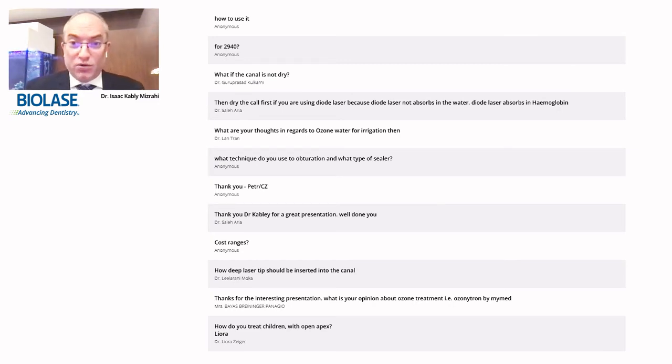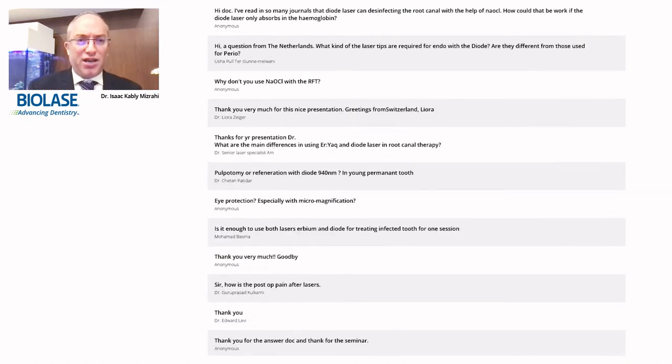Great question from Dr. Leora. How do I treat children with open apexes? That's exactly one of the biggest points of these radial firing tips. If you go down to the working length, you will not extrude the irrigant through the open apex. You will create a negative pressure, and you will create that cavitation effect from apical to coronal in order to get the disinfection, cleaning and ablation of that possible smear layer around the root canal walls. So it works great.